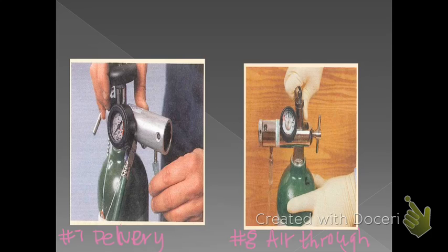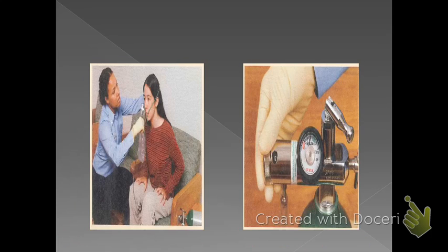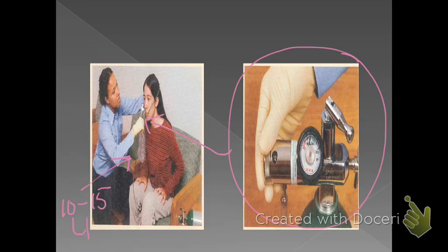This is a big deal because we want to confirm that air is flowing before we put it on our patients. Put the delivery device on our patients, and then last but not least, we just want to confirm again that our liters per minute are appropriately set for the particular delivery device. Since this is a non-rebreather mask, we're looking at about 10 to 15 liters per minute. So it looks like we're within normative values here.